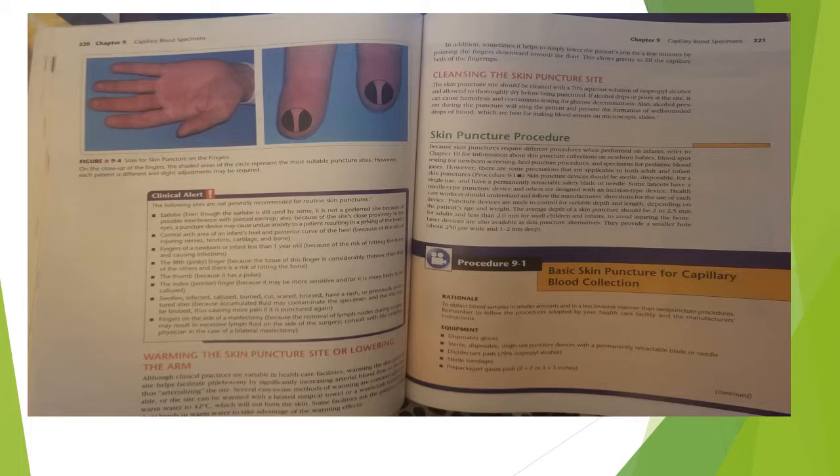Puncture devices are made to control the variable depth and length, depending on the patient's age and weight. The average depth of skin puncture should be 2 to 2.5 millimeters for adults and less than 2 millimeters for small children and infants to avoid injuring the bone. Laser devices are also available as skin puncture alternatives. They provide a smaller hole.